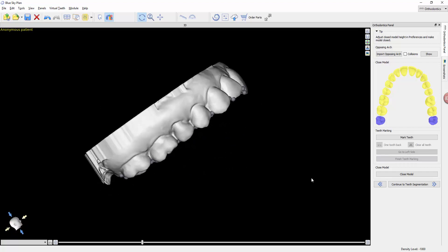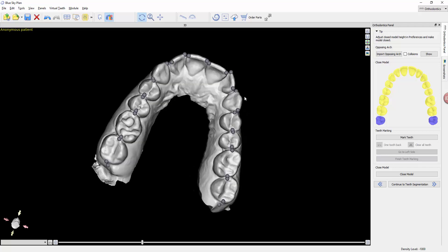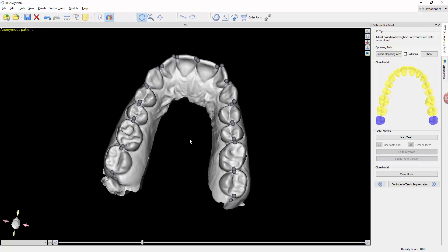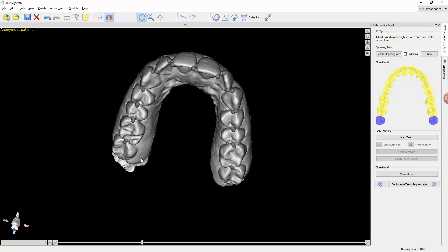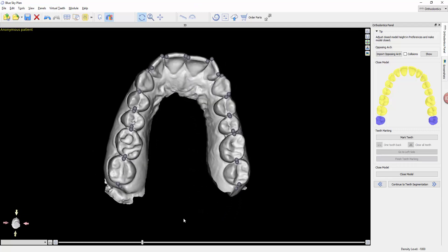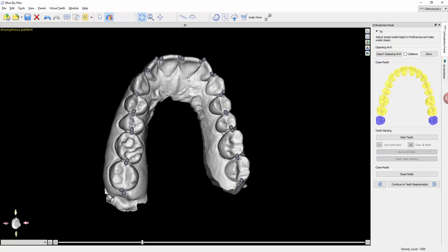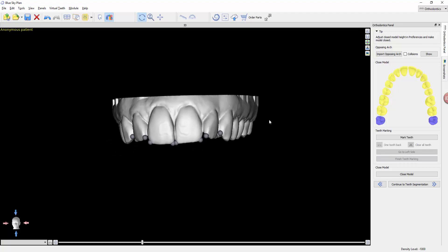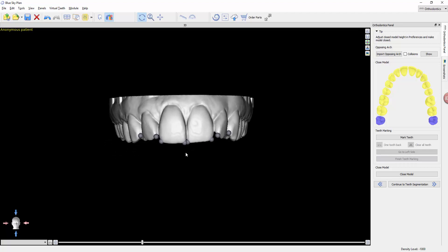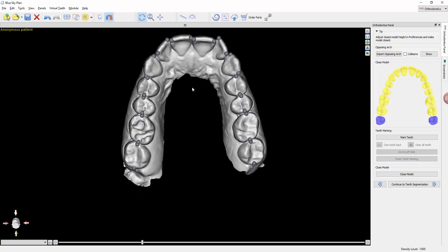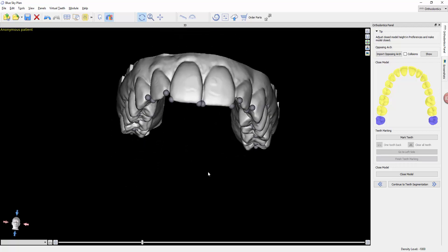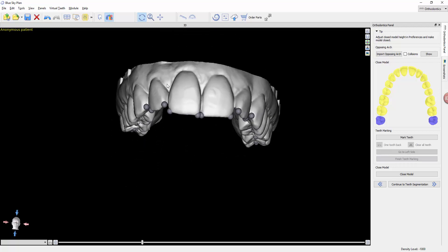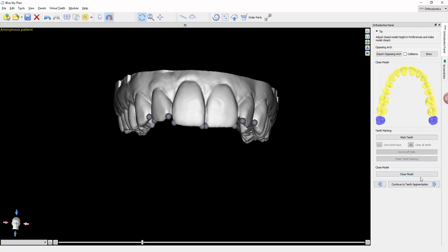Bear in mind that selecting all the teeth is important, because if you don't, it may end up actually cutting off the cusps of the most distal teeth or the teeth that are ignored, just because it sort of loses orientation. So don't skip that step. Spend the full amount of time and mark all the teeth. You don't have to mark the third molar, the teeth to be ignored, but otherwise you do need to mark every tooth. That's the end of this step. The next step will be the actual tooth segmentation step. I'm going to click on that button and let it load and do its processing.